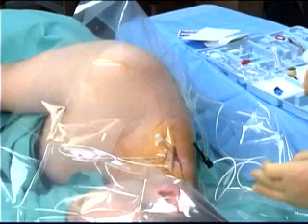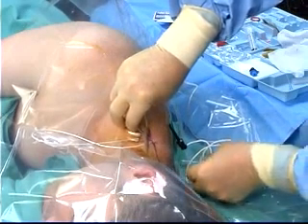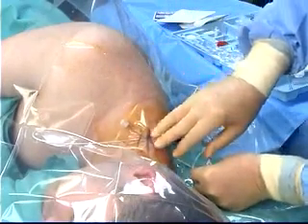If a skin bridge is not required, the needle stylet enters through the same site as the catheter, taking care not to damage the catheter. This area has already been anesthetized. The needle is now railroaded retrogradely over the stylet, and the stylet is removed.